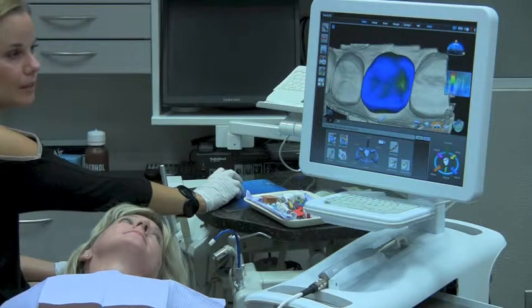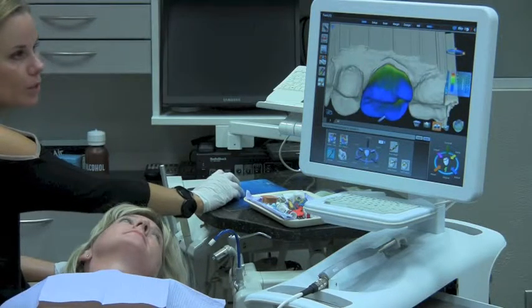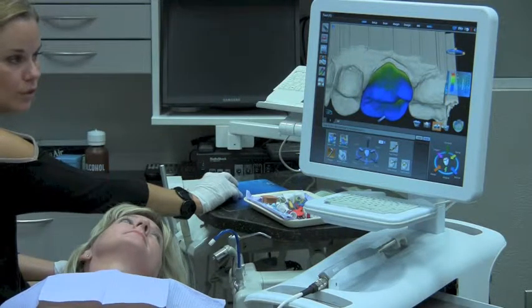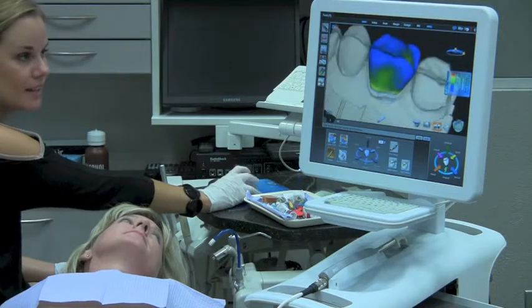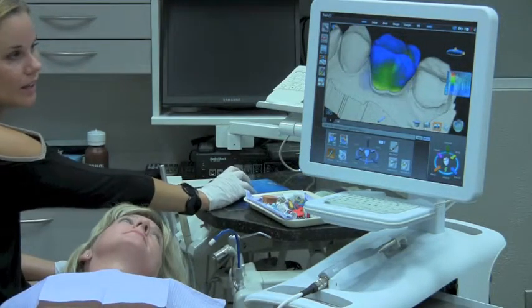Occlusally we're really good — maybe a little thin area here. Lingually, I might thicken up this margin area just a little bit by dropping a little material on there using the dropper tool — virtually waxing. Same thing on the buccal: I might drop a little bit here just to thicken that area up.